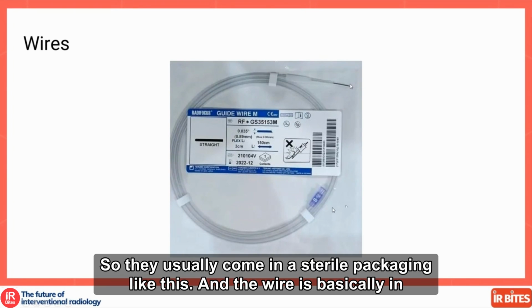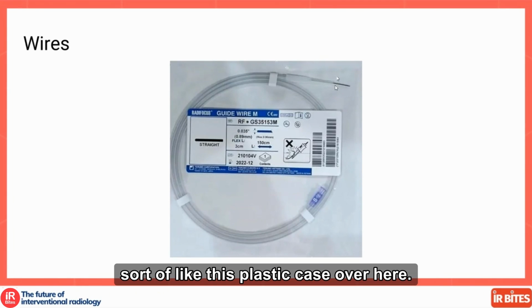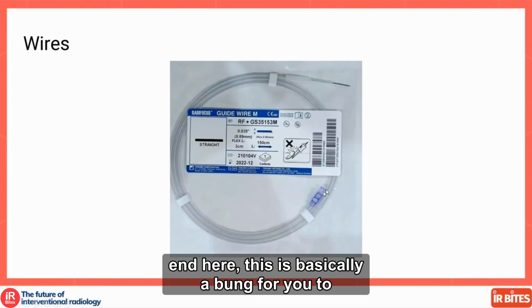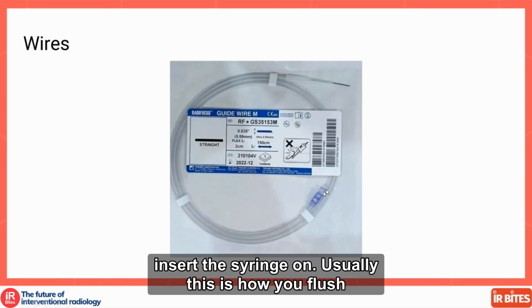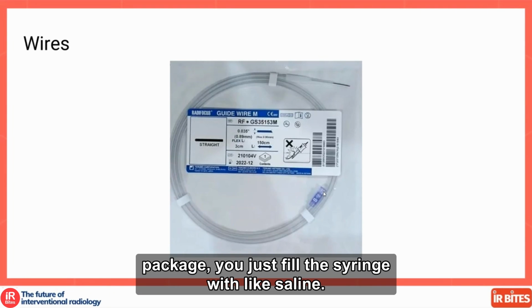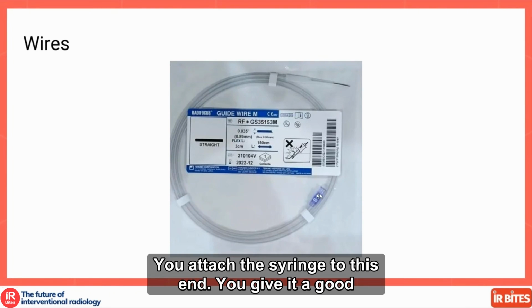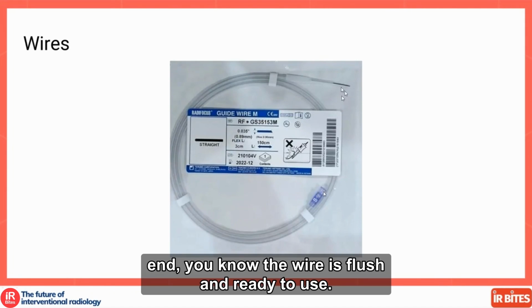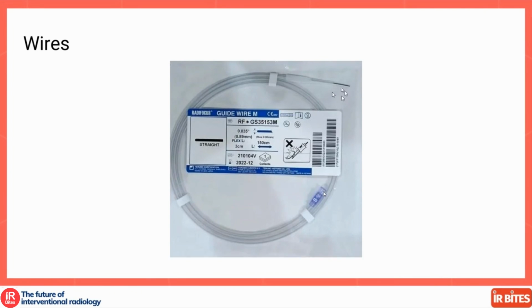They usually come in sterile packaging like this, and the wire is in a plastic case over here. This would be the tip of the wire, and this end here is a bung for you to insert the syringe on. This is how you flush the wire initially. When you take it out of the package, you fill the syringe with saline, attach the syringe to this end, and give it a good flush. When there's saline coming out from this end, you know the wire is flushed and ready to use.